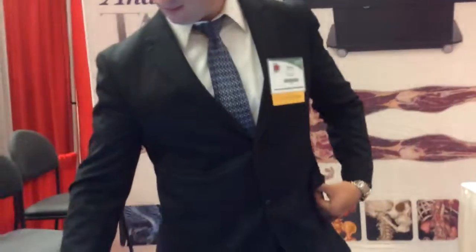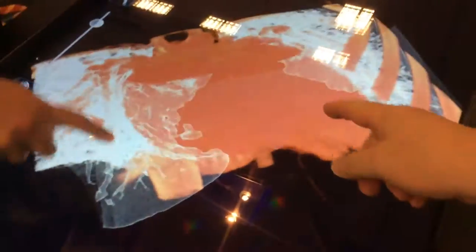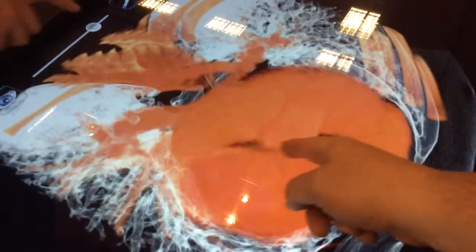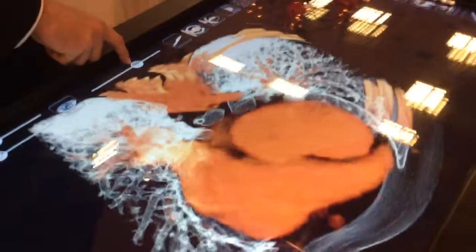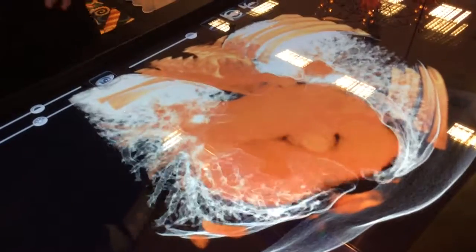That's interesting. Okay. You going to show me something else there? Yeah, so here it's just different rendering visualizations that you can play with on the table. Oh, okay. That looks like a heart valve. Am I right? I'm not sure if you'd be able to see valves specifically. So does that opening there look like a valve to me? Yeah, I'm not sure. It'd be pretty hard to make out the valve. I mean, you can show where it would be, but on a CT scan, it's really hard to make it out.